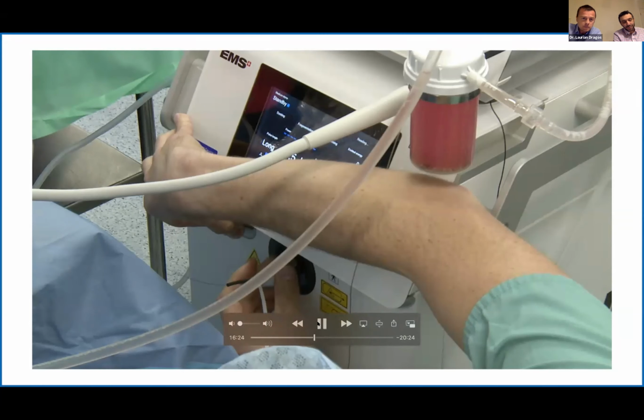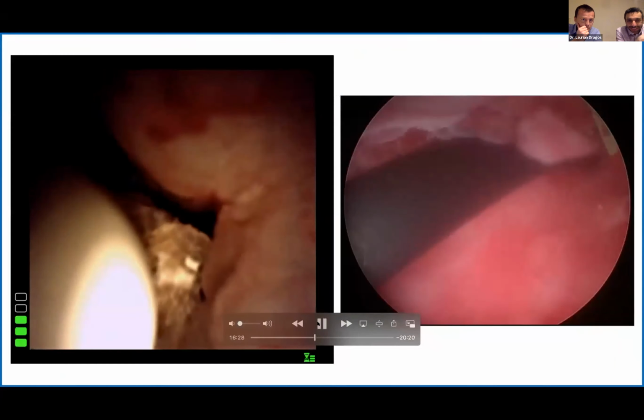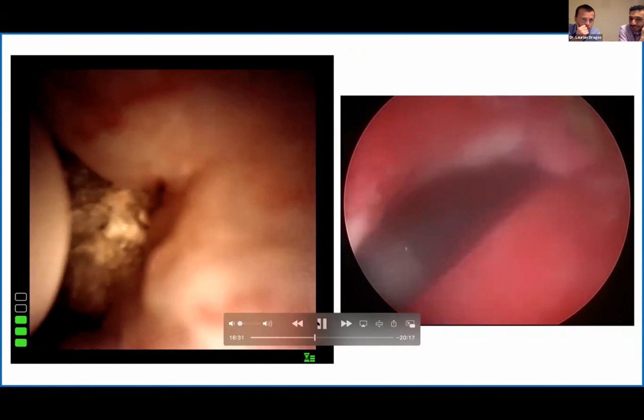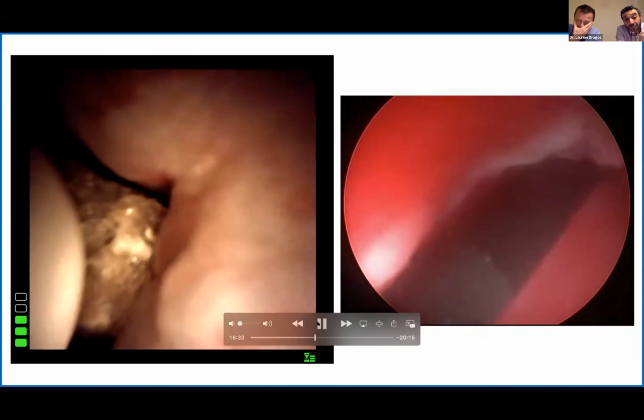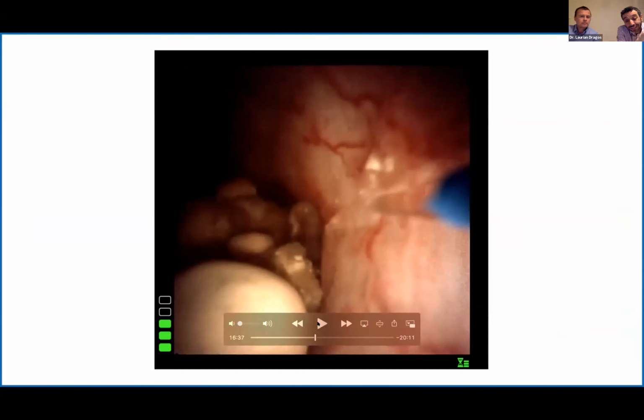I think it's a very valid point that Laurian's made. He's very meticulous about laser and breaking fibers. Maybe that's because of his interest in the temperatures, but it is a very important point. And today I went to theatre and my registrar had started the case. There was a long laser fiber trailing between the laser machine and the case. And I almost broke a fiber because, as you know, they're very fine. And if you just enter theater, you're not really fully aware of the whole thing, but if there was no gap, that wouldn't have happened. So they had to stop me saying, you're about to break the laser.